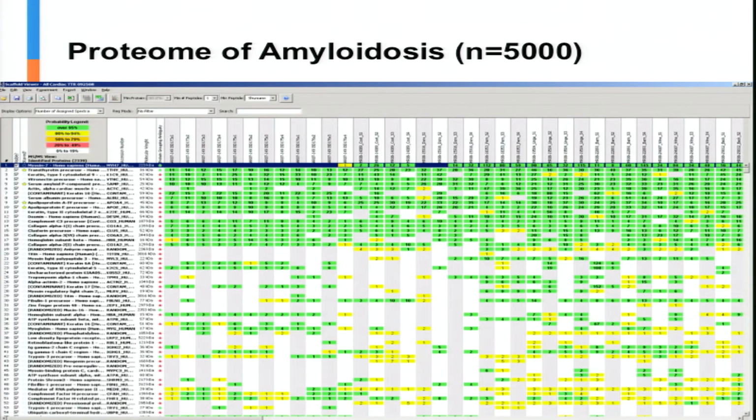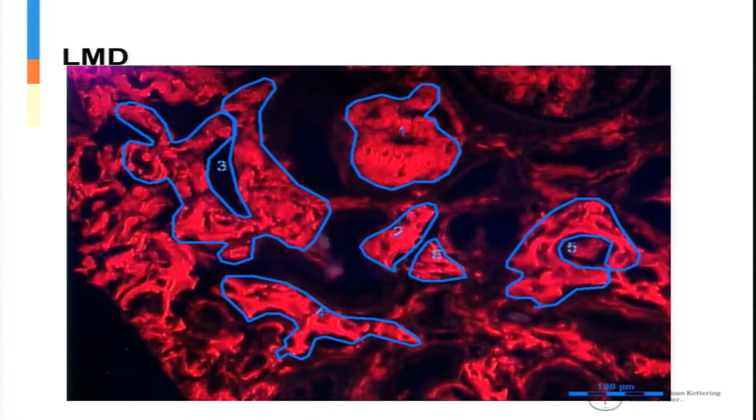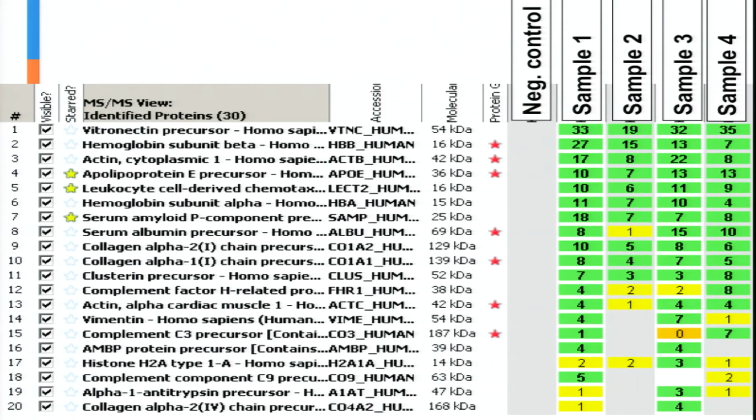So with this tool, of course, we can ask more interesting questions. We have thousands of these proteomes, and then you get a case where all our conventional amyloid stuff was negative. This was a kidney biopsy from a Hispanic patient, who was involved with amyloidosis. We did our microdissection and looked at it. Really there's nothing there: we have ApoE that tells us amyloid, but in this list there is nothing that I can recognize as causing amyloid, so this was inconclusive.